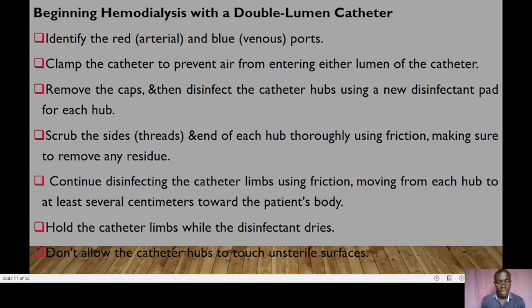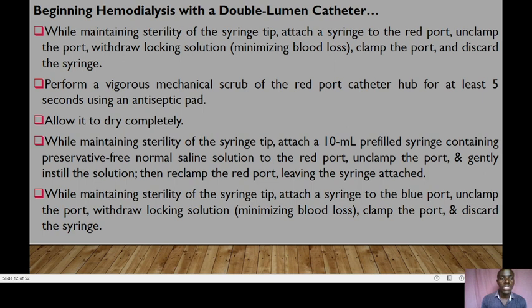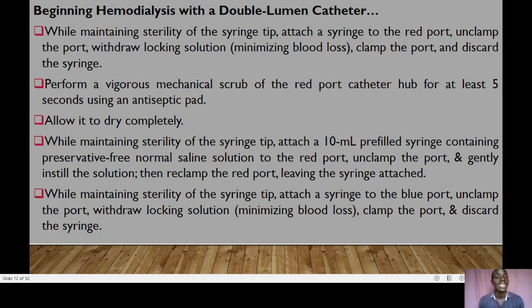Before beginning hemodialysis with a double-lumen catheter, identify the red and blue ports. Clamp the catheter to prevent air from entering either lumen. Remove the caps and disinfect the catheter hubs using a new disinfectant pad for each hub. Scrub the sides and end of each hub thoroughly using friction to remove any residue. Continue disinfecting the catheter limbs using friction, moving from each hub at least several centimeters toward the patient's body. Hold the catheter limbs while the disinfectant dries, and do not allow the catheter hubs to touch non-sterile surfaces.